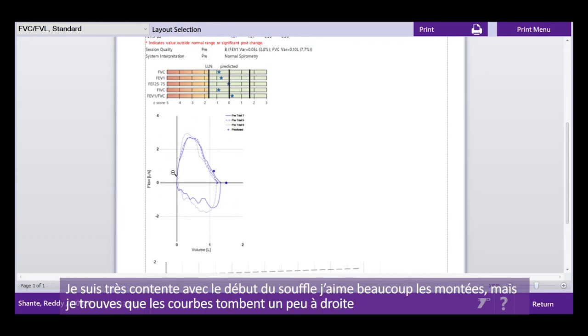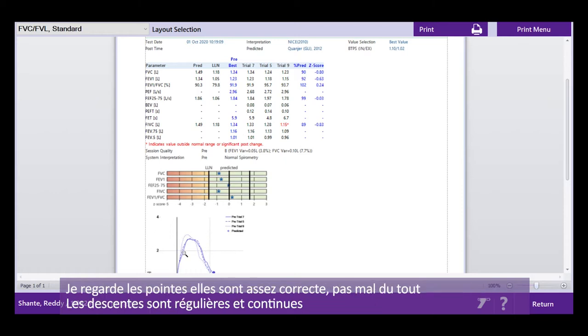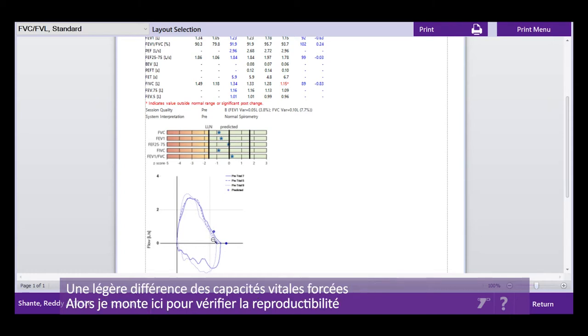Now, I'm very happy with the start of the blows. I'm very happy with the rises. I'm worried that they're falling a little bit to the right. So at this point, I would check my peak expiratory flow time. All of them are within the allowed time limit. So it means she did blow fast enough. I'm looking at the peaks. They're pretty reasonable, not too bad. Downward curves are nice and smooth and continuous. Slight difference in the forced vital capacities.